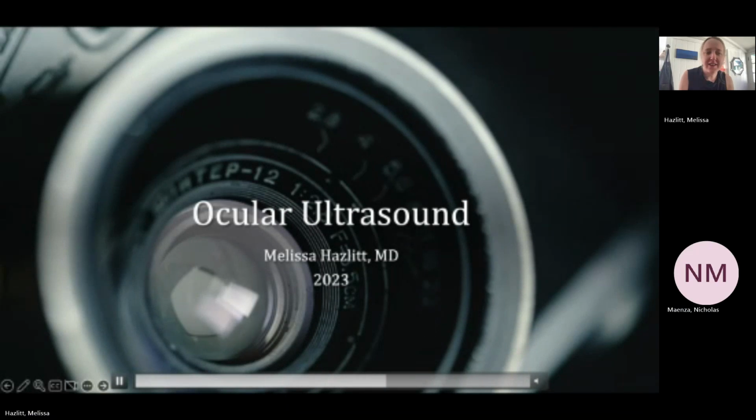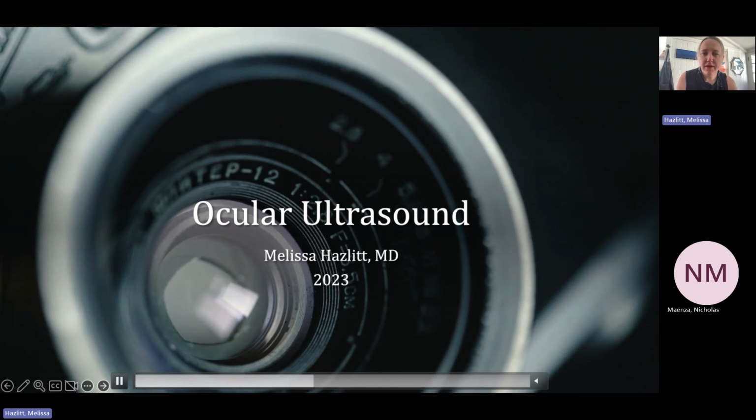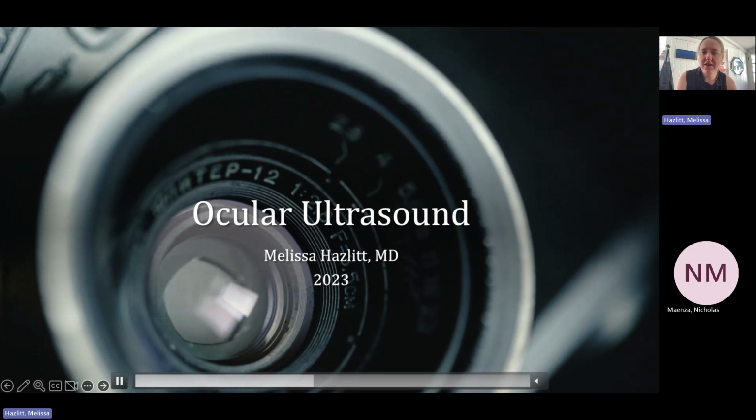All right. So I think ocular ultrasound is something that we use a lot because it gives us a lot of information and is a fairly straightforward exam. This is some of the straightforward stuff that we've already done, but then some more of the newer uses that I've been playing with a little bit, or at least just considering as things to add to our arsenal of eye ultrasound.